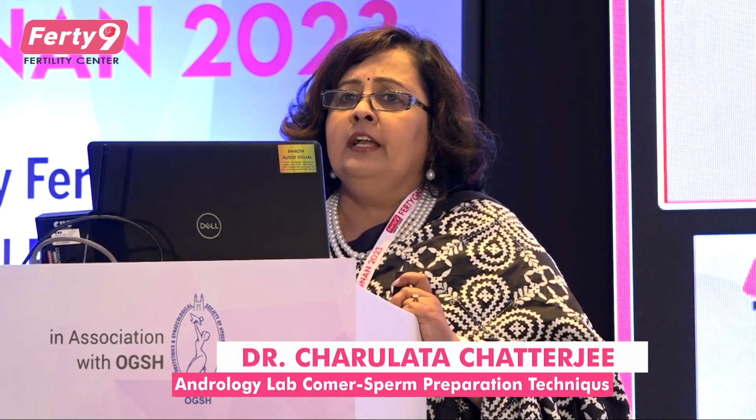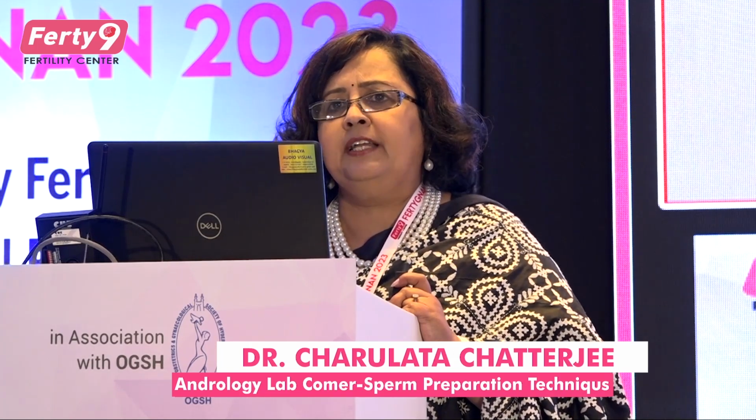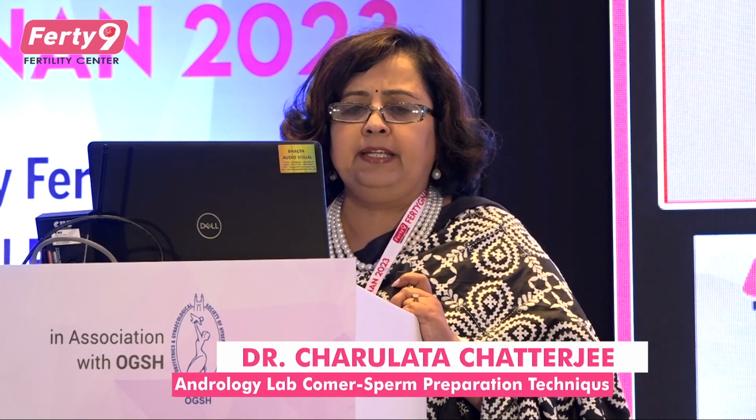This method is really good. It gives us a good retrieval of the motile spermatozoa. It can be used for any kind of insemination, either conventional IVF, IUI or ICSI.